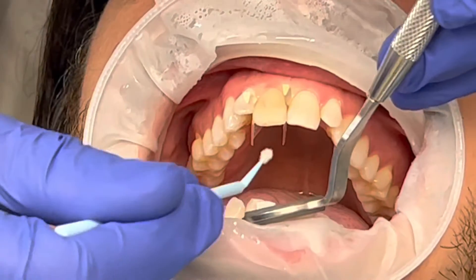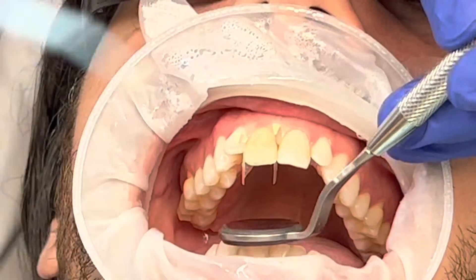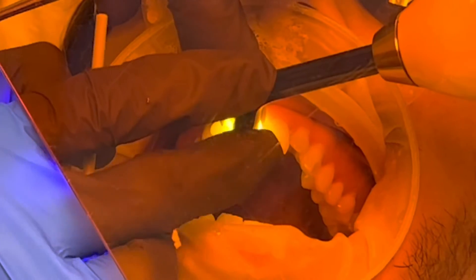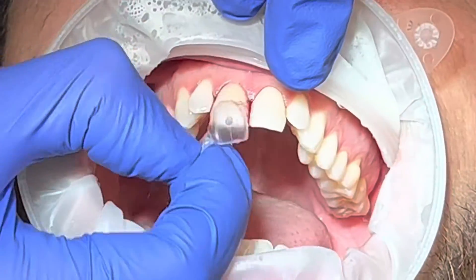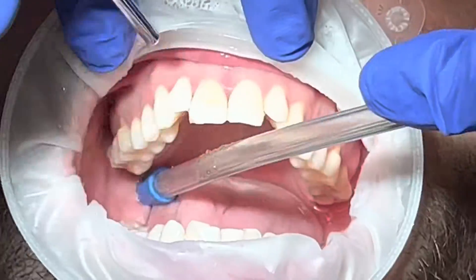After we do the injection into the template and clean everything, before you cure with the light, make sure that you remove the lingual part — the accessory material on the lingual side. This is how you take it out. It looks gorgeous, right?